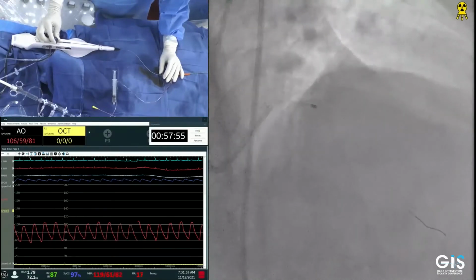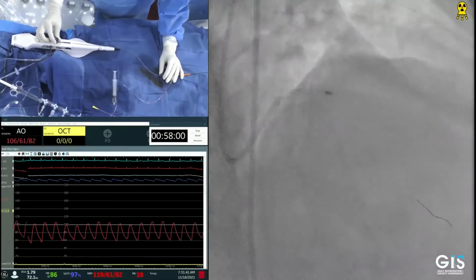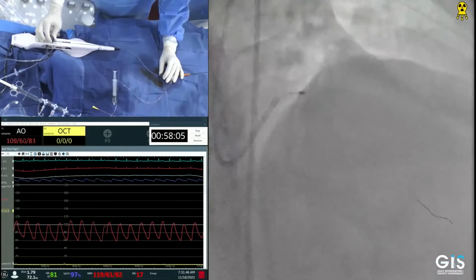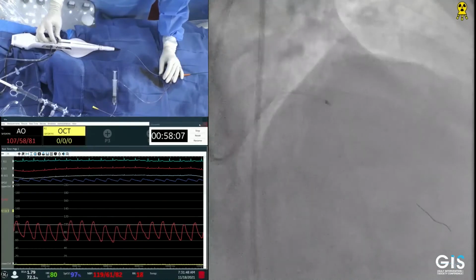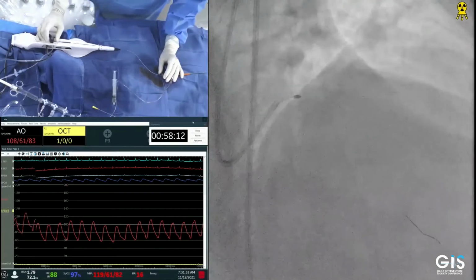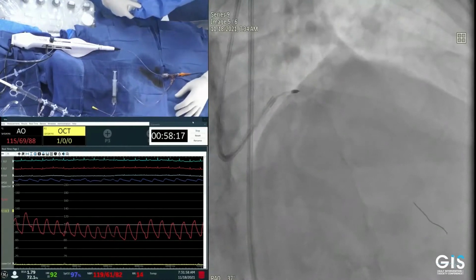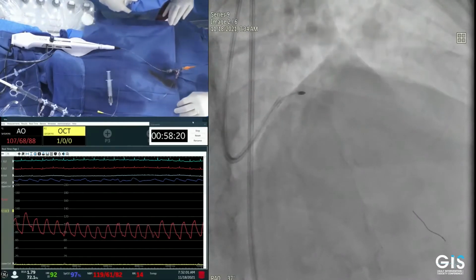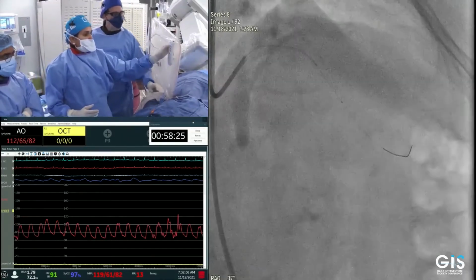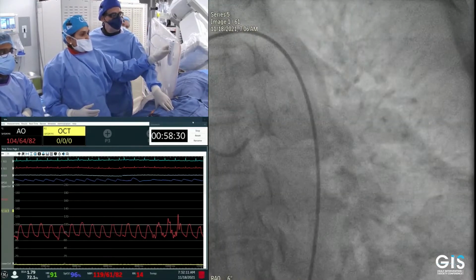Since you are an expert in the field, will you do imaging? Here, will you go with the non-compliant balloon before you do rotablation? Do you need to do rotablation here, just looking at it angiographically, without imaging? I think I'm going to do rotablation as I did, because it's usually better to prepare your lesion before you get stuck with an underdeployed stent. My question is, angiographically it doesn't look severe to you. It's only the imaging that helps tell you it's severe or not, isn't it? Otherwise you could have missed it. I'm talking about this lesion. Yes, I go ahead and do everything.